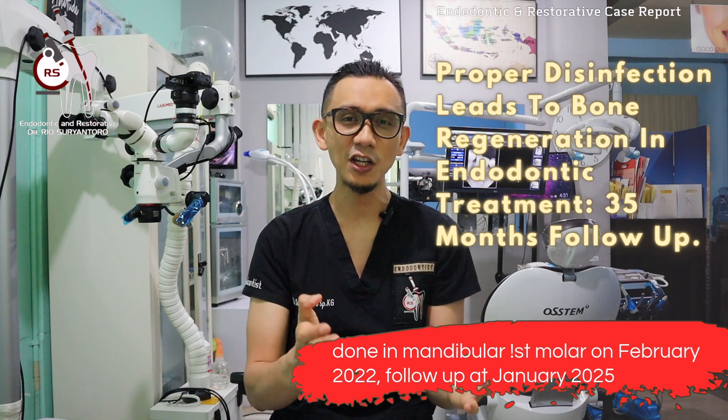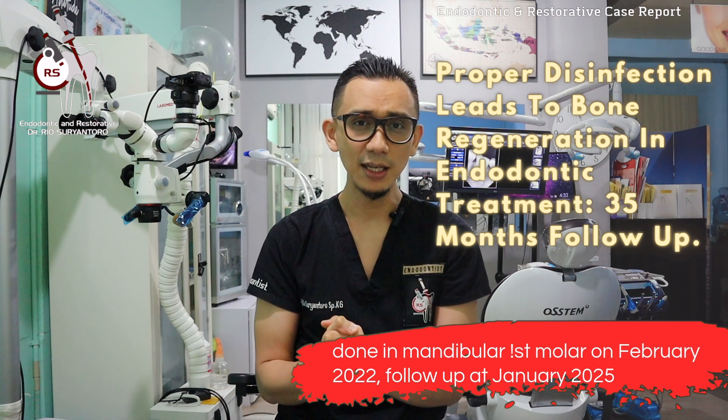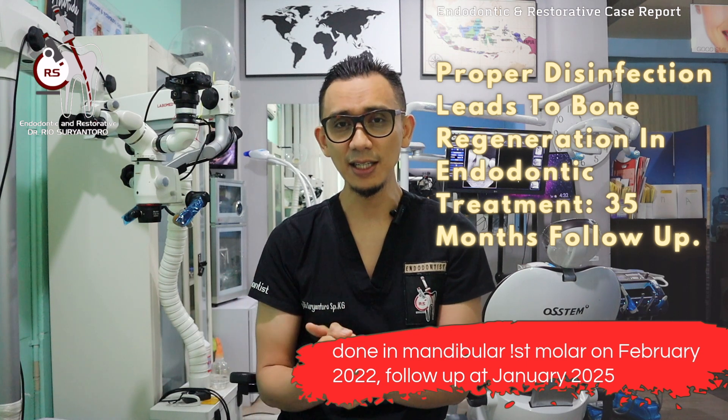This treatment was done in a mandibular first molar. What's so special about this case? First, we have a three-year follow-up and the bone regenerates well following a single-visit endo. Second, the restoration is still intact after three years — I did a direct composite restoration instead of an extra-coronal indirect restoration, and the restoration is still intact although there is an issue with oral hygiene.